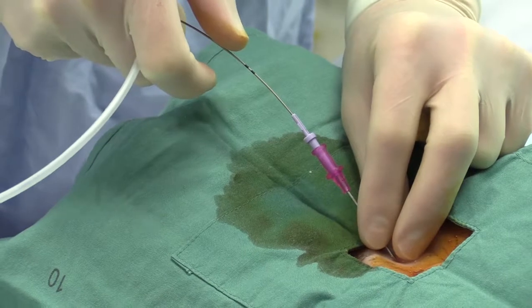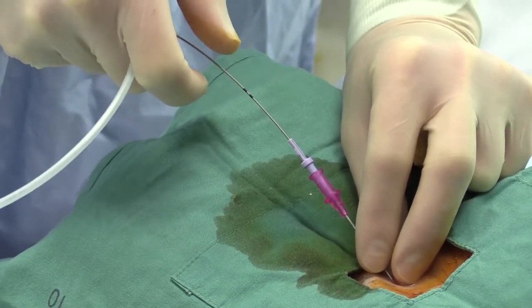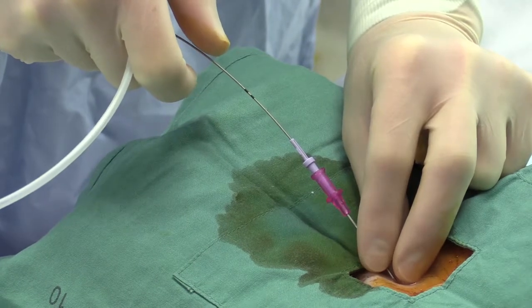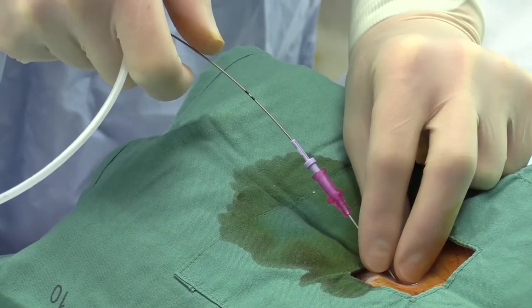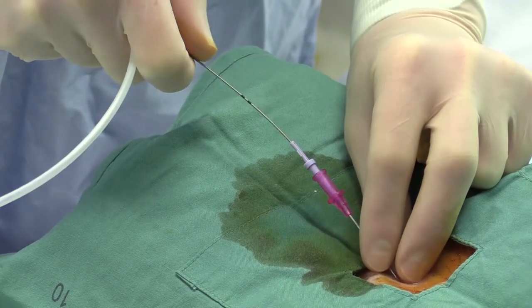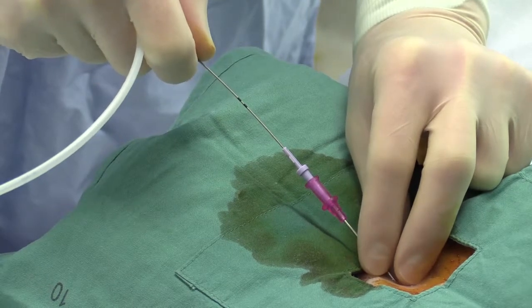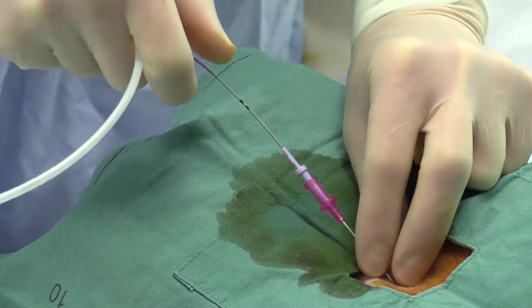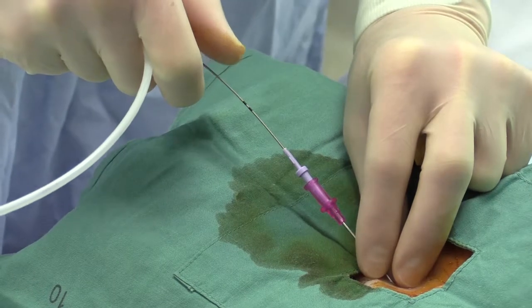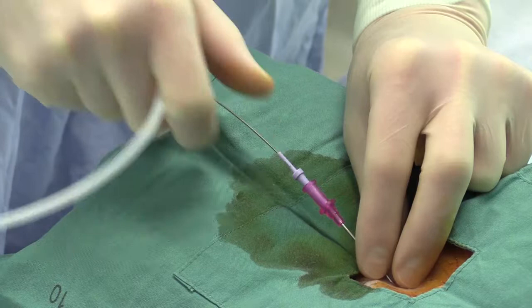pushing, releasing, pulling back on the plastic casing of the guide wire, pinching it again, and advancing it. Remember the needle position, it's facing inferiorly towards the coccyx, hoping that you can direct the guide wire into the pelvis, behind the bladder, and or behind the vagina in females. So where one really wants to be is in the pouch of Douglas, either between the bladder and the rectum, or between the vagina and the rectum in females. The guide wire is advanced.